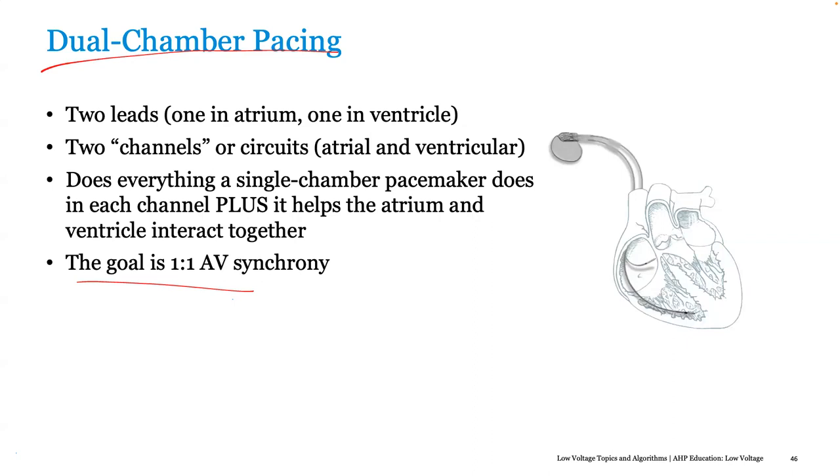Look, in my experience, with someone with chronic atrial fibrillation, an atrial lead doesn't bring anything to the party. You're better off just putting in your LV lead and your RV lead, and capping off the atrial port. Even if you did put an atrial lead in, the device isn't going to use it. All it's going to do is mode switch to DDI anyway, which is a non-tracking mode, or you end up programming a VVI anyway. So your atrial lead's only going to give you a bit of atrial information, which is going to tell you that they're in atrial fibrillation, which you already know anyway.